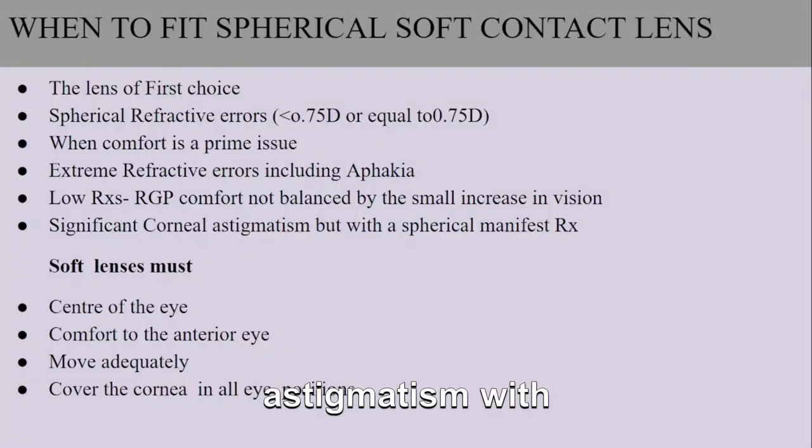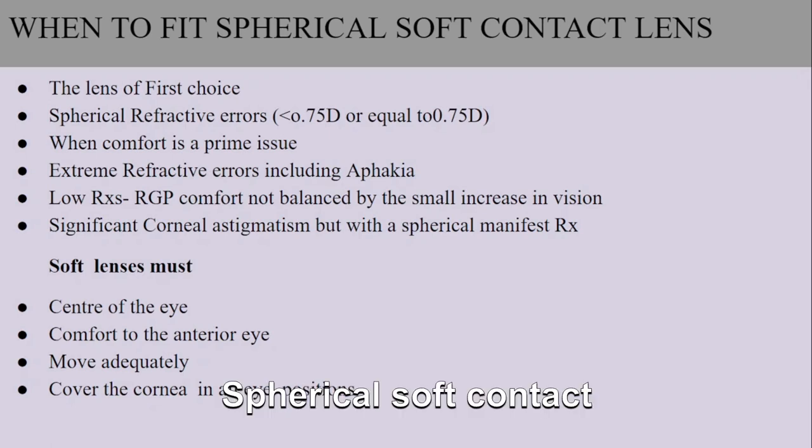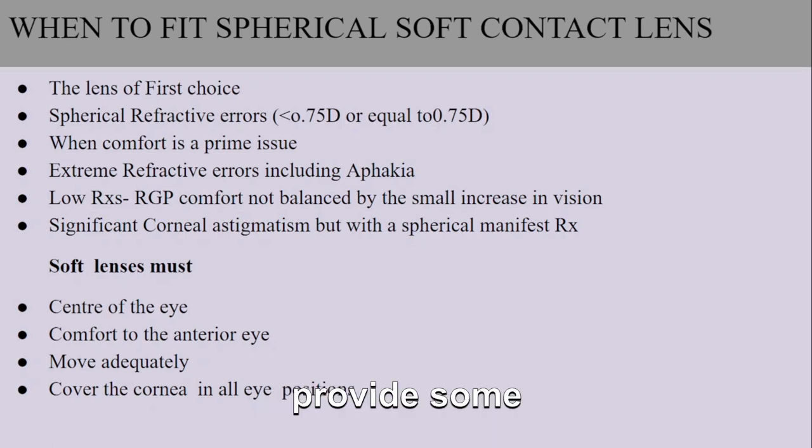Number 5. Significant corneal astigmatism with spherical manifest Rx. If you have significant corneal astigmatism but your overall refractive error is spherical, spherical soft contact lenses can be a suitable choice. These lenses can correct the spherical component of your prescription while allowing the cornea to provide some astigmatism correction naturally. When fitting spherical soft contact lenses, it's important to ensure that they meet specific criteria for optimum performance.